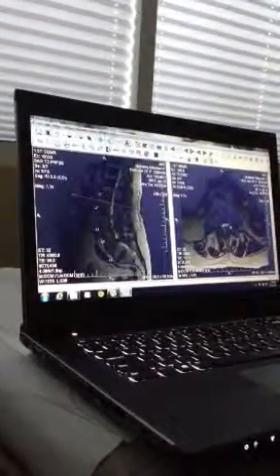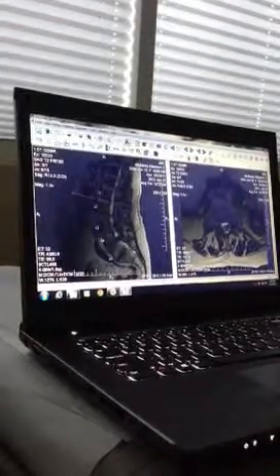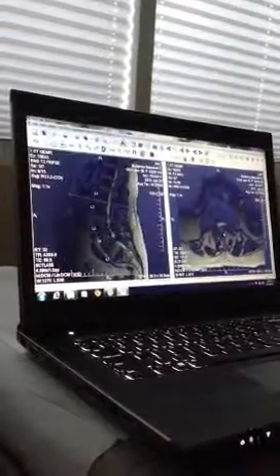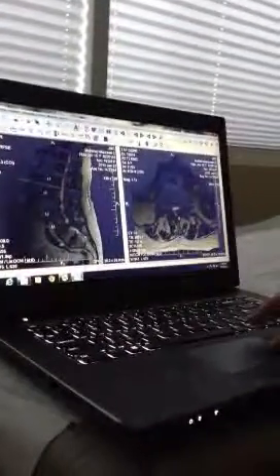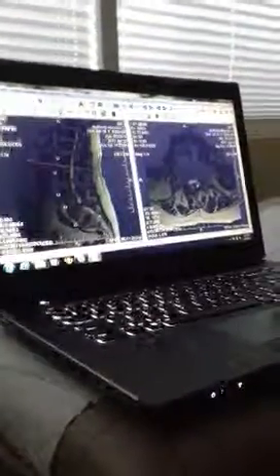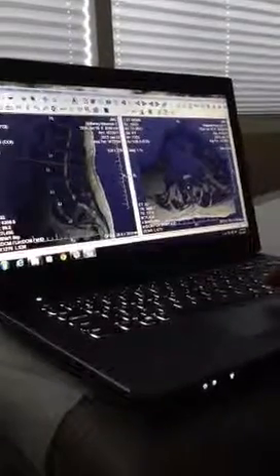So then I get to this black structure right here. Can you see that in a triangle? That's the ligamentum flavum that I talked about, yellow ligament. That's the ligament that tends to grow as we age, or with a lot of steroid injections. Not 3 or 4, but 15 or 20, for example. And so this ligament tends to grow.